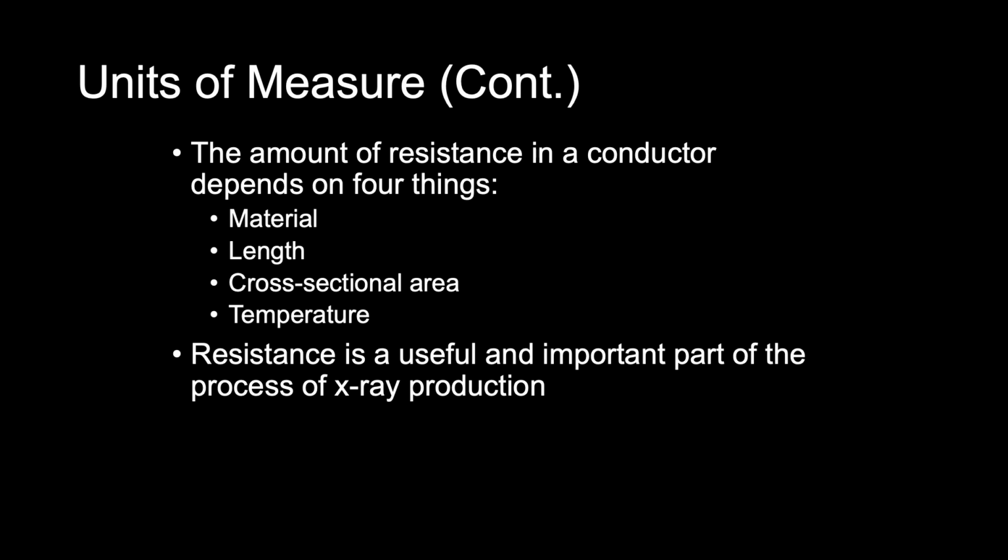Although resistance may sound like a hindrance to the X-ray production process, actually it's useful and it's an important part of the process of X-ray production. So we have to have that resistance to be able to produce the X-ray photons.